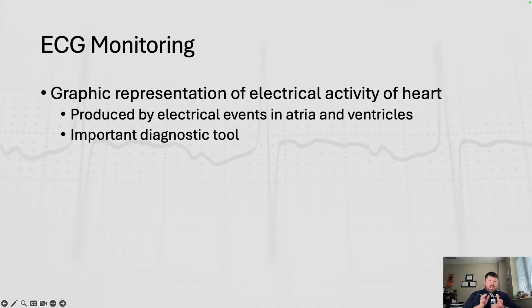So remember, as we're going into this monitoring, your cardiac monitor has several different leads on it that show you a picture or a vantage point of the same electrical conduction as it's going through the heart. It's just going to show you a view from the different areas of the heart as that same electrical conduction is going through.